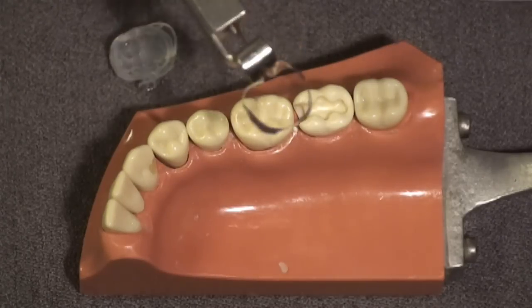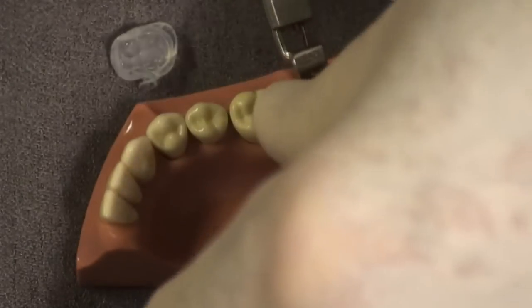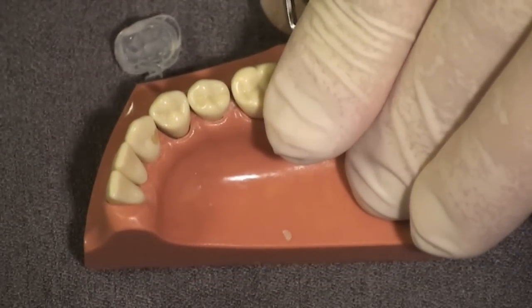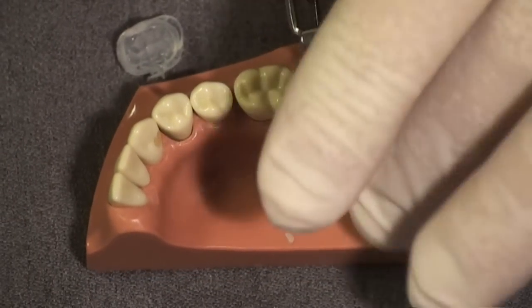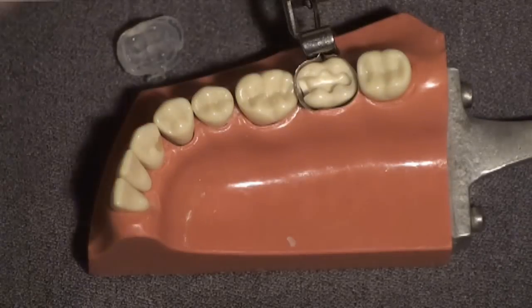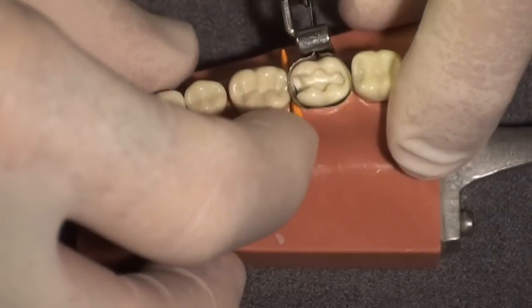You're then going to replace the matrix band that was placed on the tooth when you took the custom matrix impression at the beginning of the appointment and tighten it the way you normally do. Then take a wedge and wedge this the way you normally would.